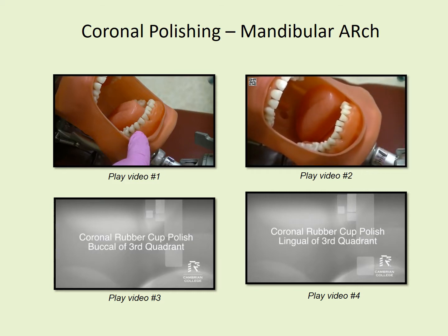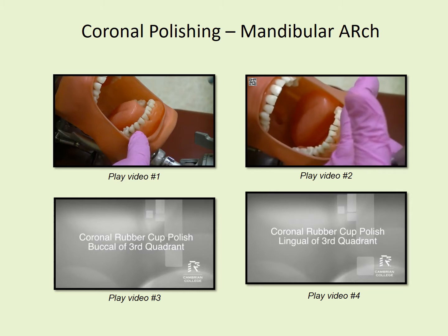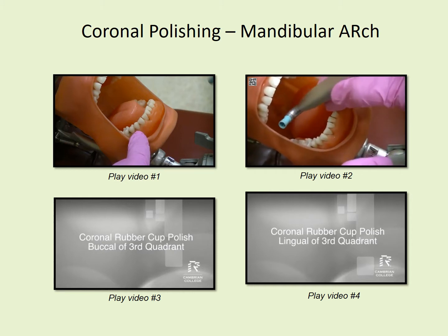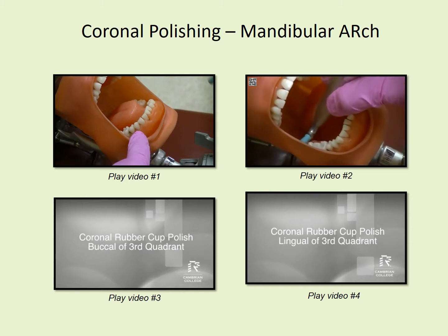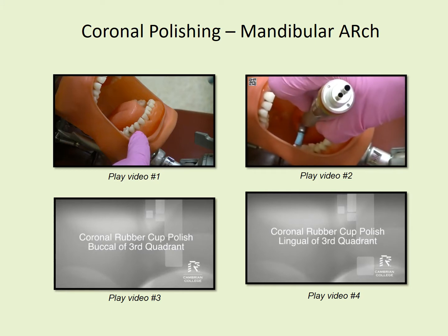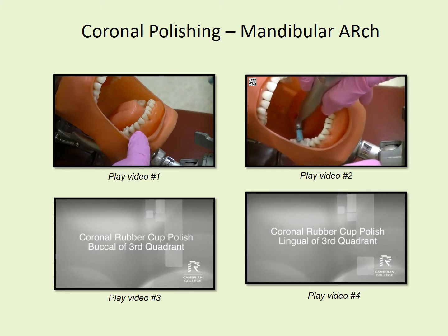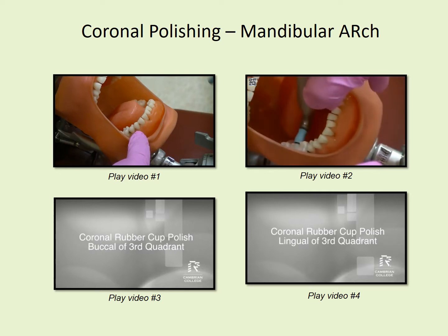Okay. Lingual of the fourth quadrant for the polishing. Run your saliva ejector across again. Polishing paste on. Turn your saliva ejector off. Then you can fulcrum on the anterior area with your polishing handpiece. Retract the tongue with the back of the handpiece, and start your polishing on the gingival third. Again, working from distal to mesial. If there's stain as well, go back over the occlusal third, and work your way across the teeth. Same technique all the way.